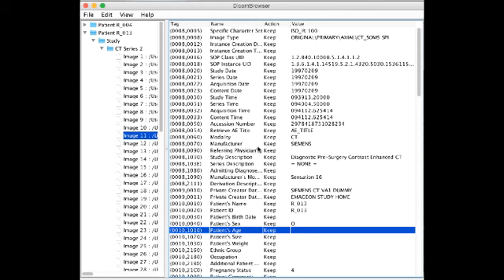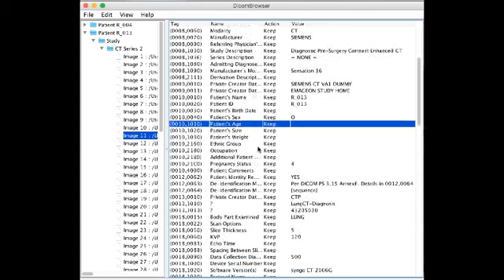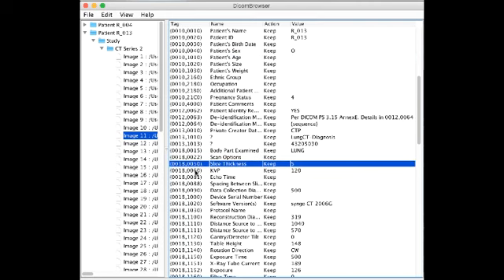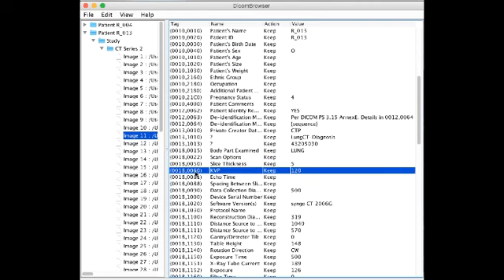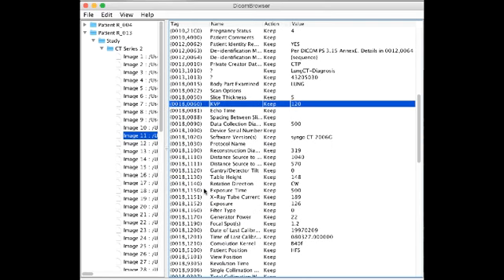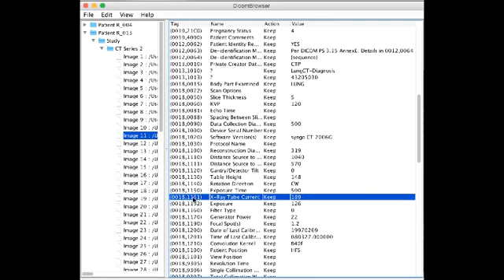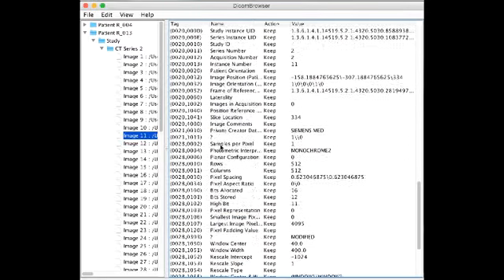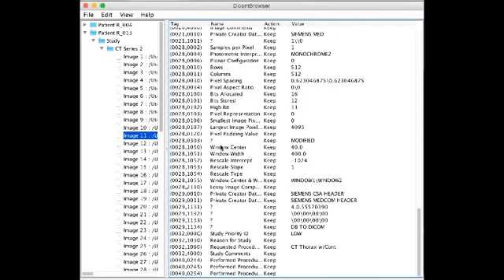You can also see parameters about the scan itself. So if we scroll down, you can see the slice thickness of the CT, the kVp that was used, and down here I think we can see the mA, X-ray tube current, and other parameters of the scan. So there's lots of useful information here for interpreting the study.